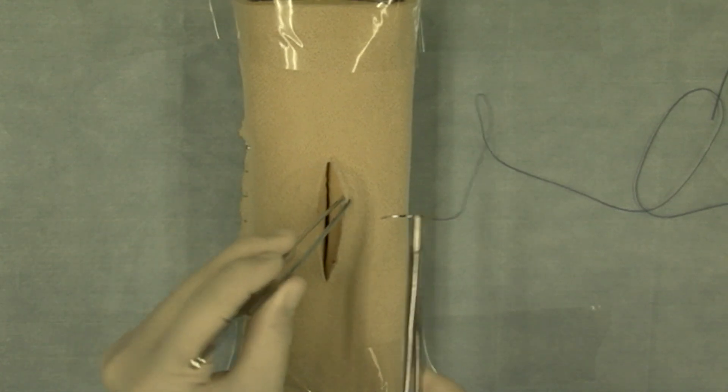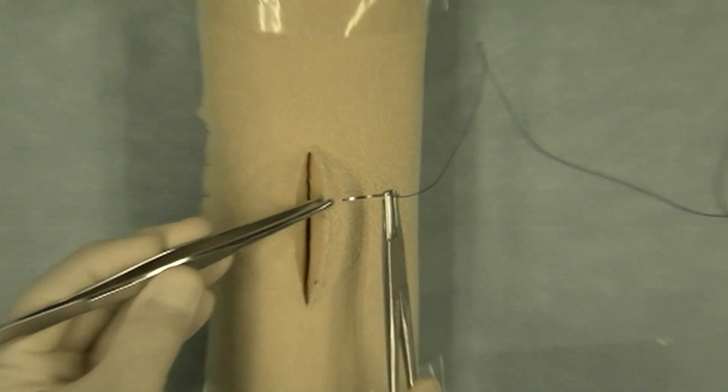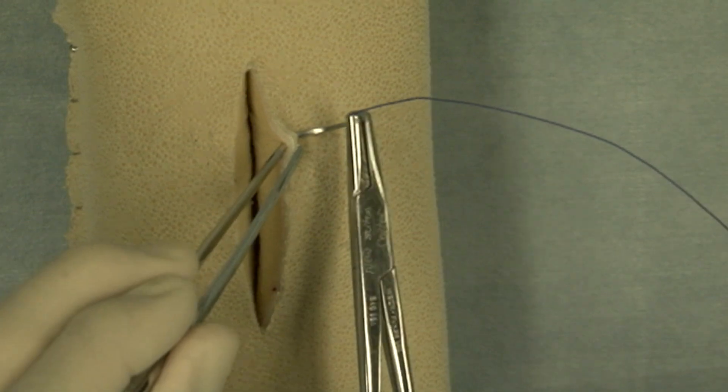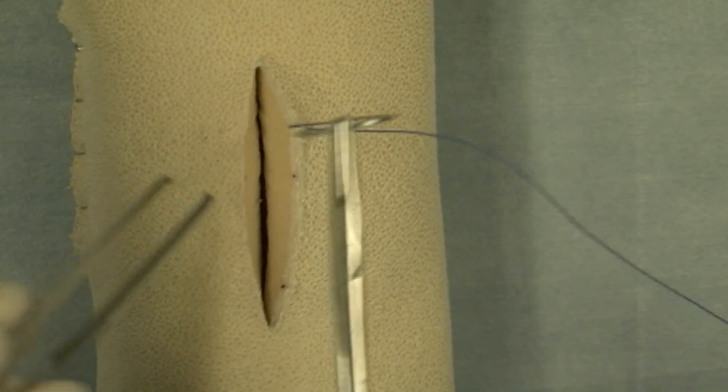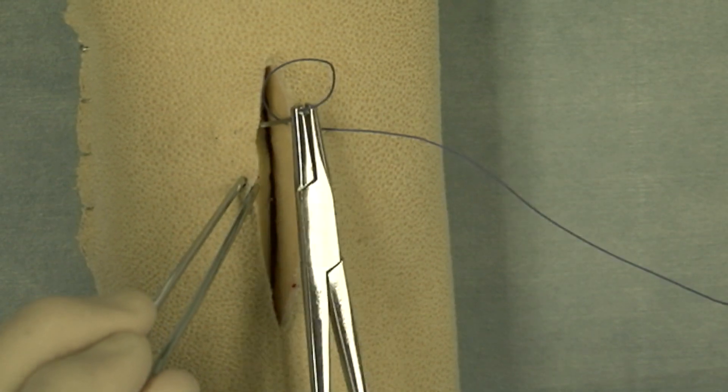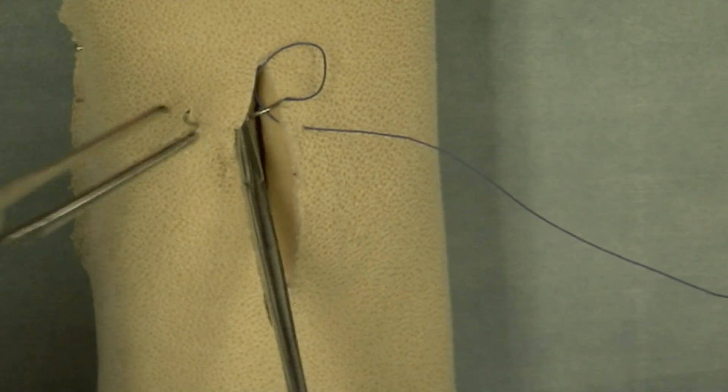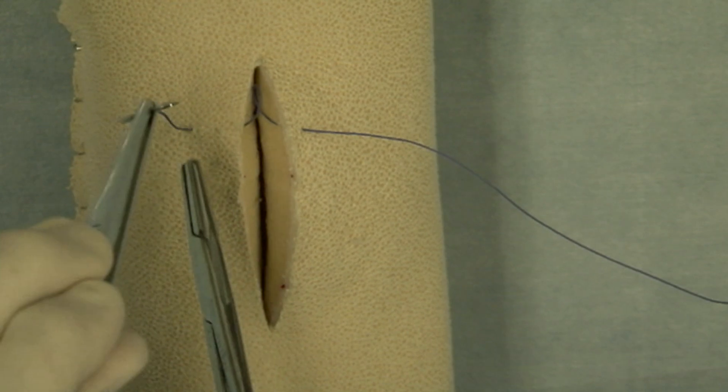I'm going to grasp the near portion of the skin. This is the near bite on the near side. This is the far, meaning far from the incision on the far side of the incision.